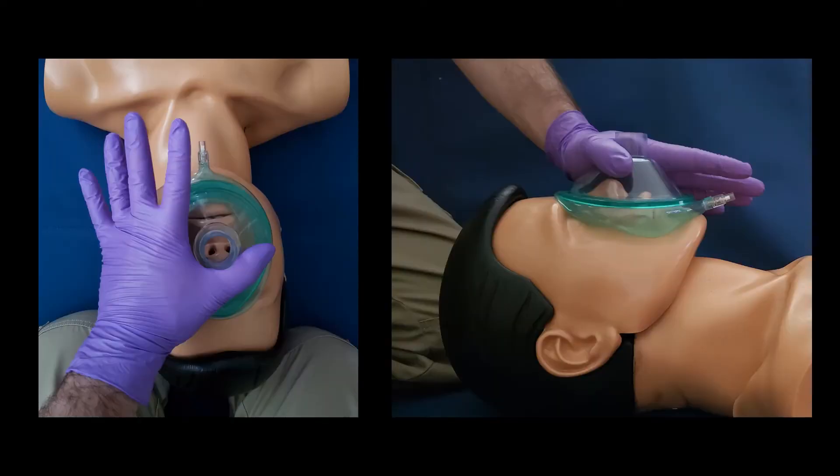The bag has been removed to allow you to see better. You can see that the thumb is at the top of the mask, and as long as the thumb remains at the top of the mask, you can rotate your hand left or right so that your three fingers can find a comfortable spot on the jaw, and your index finger will provide the top of the C as previously pictured.